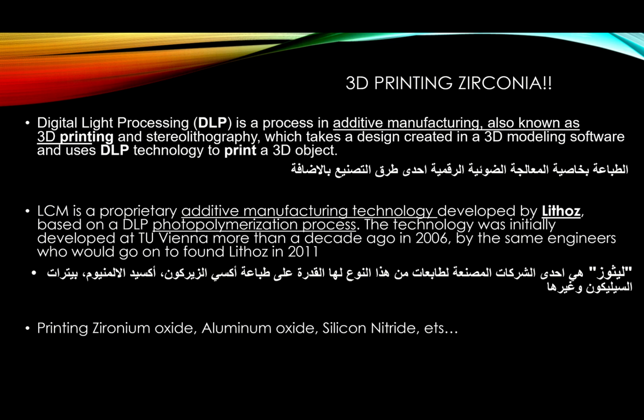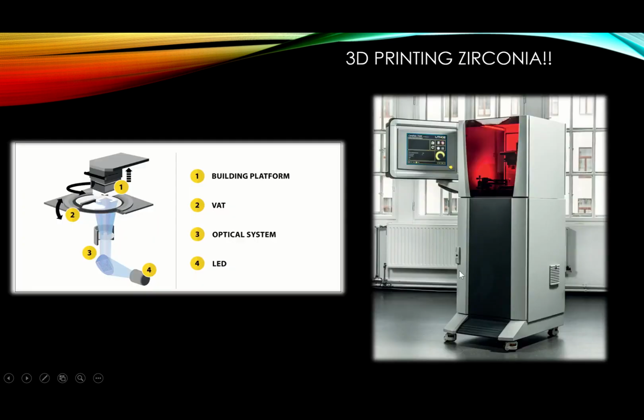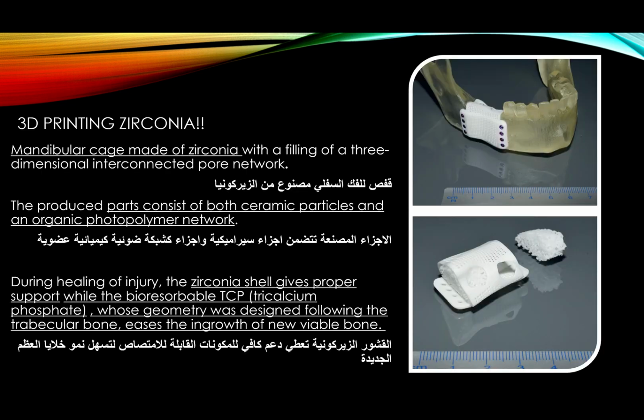All right, and I think I put a post about it towards the end of this lecture, if I'm not mistaken. They're printing zirconium oxide, aluminum oxide, silicon oxide, silicon nitride, and other things. This is their machine. It's very expensive. It's around $300,000, but it's high in performance. And I think in dental we have smaller, cheaper ones that can print zirconia these days. You can print all of the above. Mandibular cage made of zirconia. Parts consist of both ceramic particles and an organic photopolymer network. Okay.